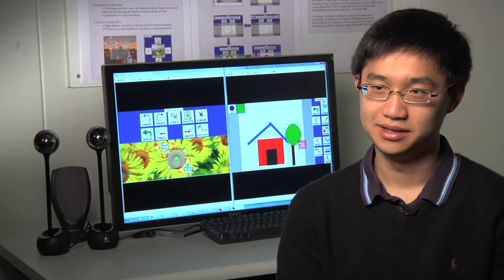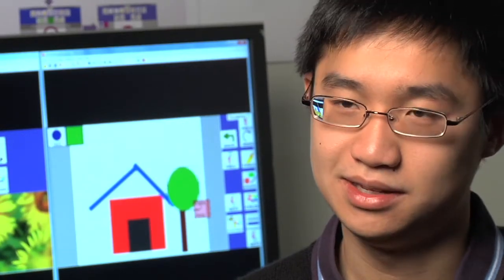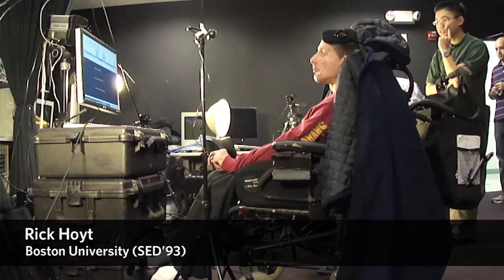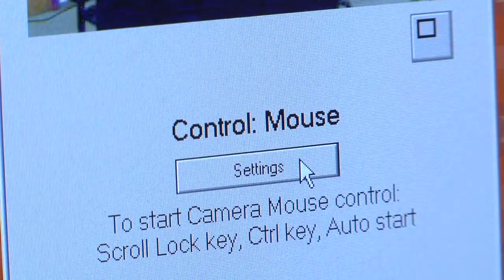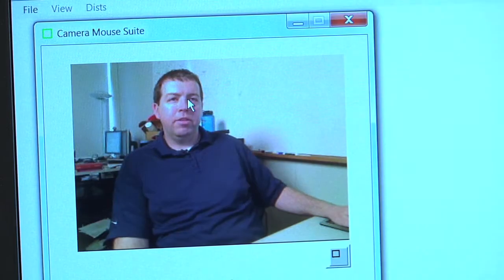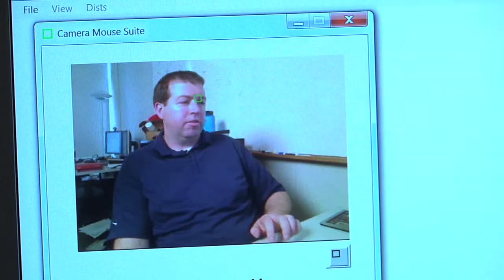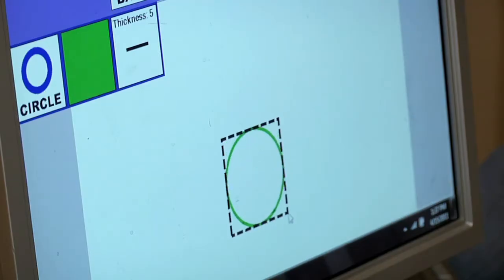The people we work with really have a wide range of ability levels, and most of them can't use their hands to use the keyboard or mouse. So my research group has developed this system called the Camera Mouse. It uses a standard web camera to track a feature on a person's face, and then their motion causes the mouse pointer to move, allowing them to control it by just moving their head in front of the screen.